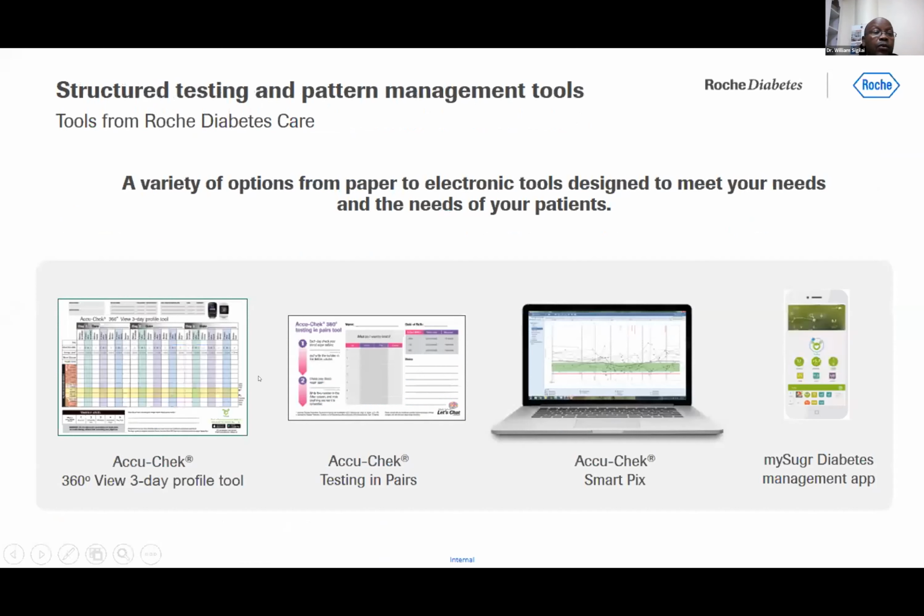The various tools. This is the logbook. This is testing in pairs, and this is your laptop or computer to draw the graphs and be able to share with the clinical team.